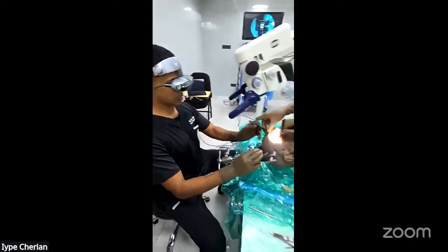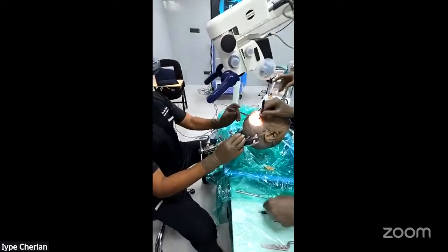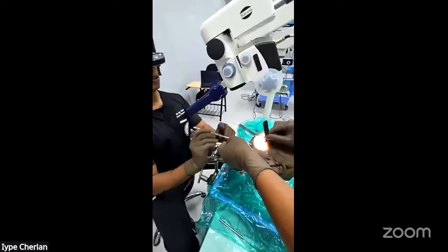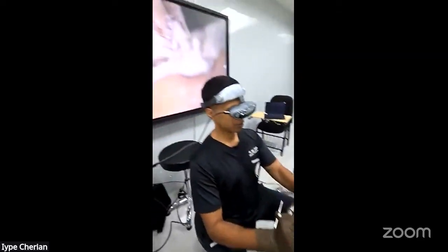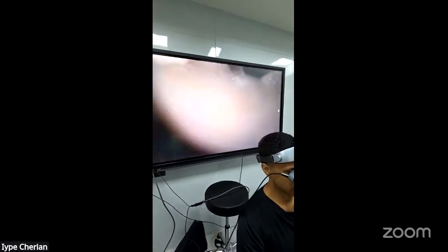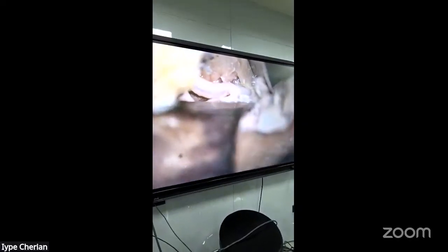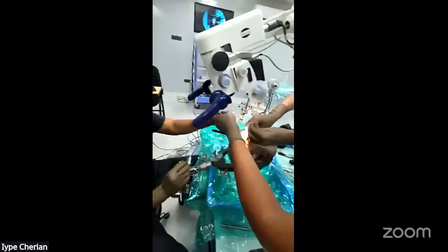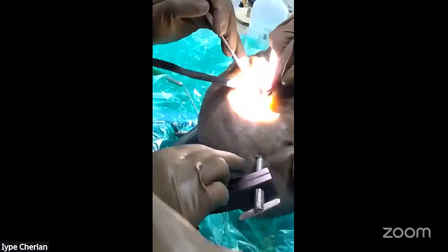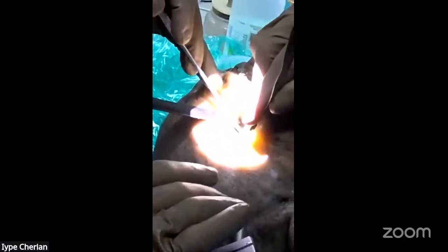Give me the instruments, please. Yes, sir. So, now the microscope. Good, thank you. Give me the other retractor.